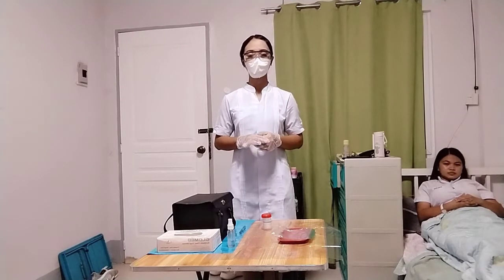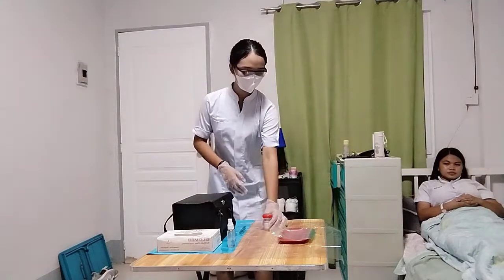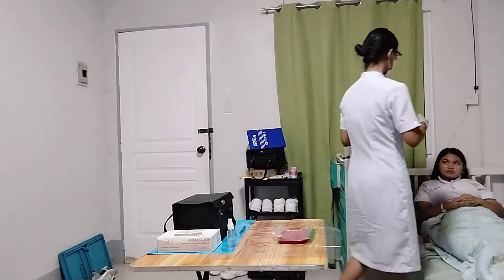Ask the client to breathe deeply and then cough up 1 to 2 teaspoons or 4 to 10 ml of sputum. For acid fast bacillus, the collection is often required for 3 consecutive days to identify the presence of tuberculosis. So ma'am, this is a sterile container.